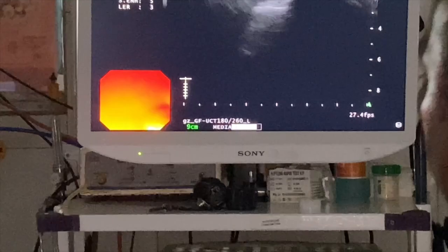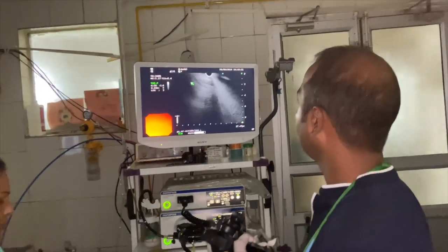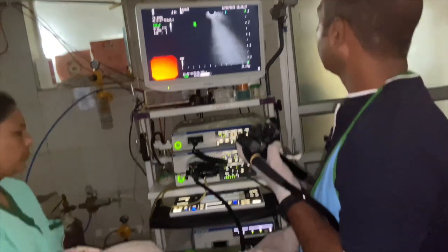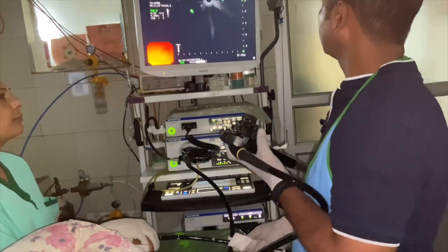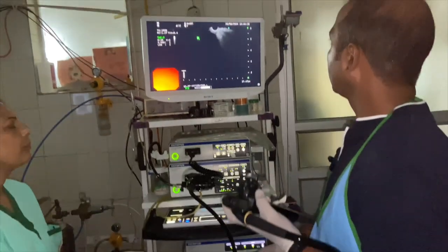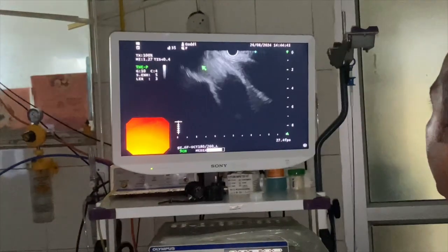second part of the duodenum. Here, check out all the areas so that you won't have any artifact, and look for the right kidney.